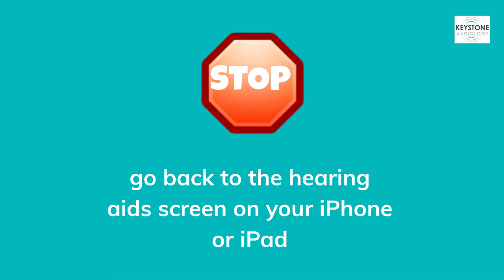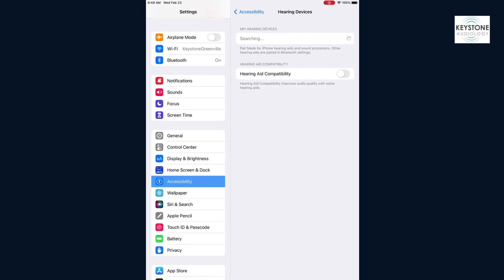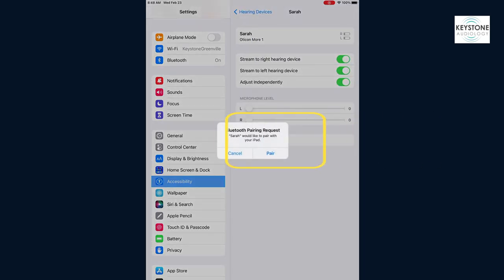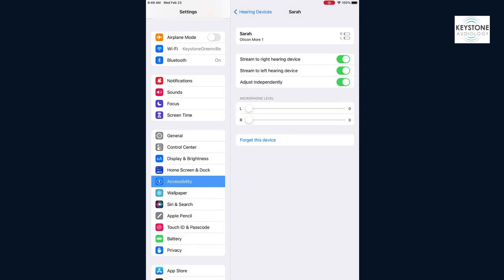Now that you've restarted your hearing aids, go back to the Hearing Devices screen on your iPhone or iPad. At the top of the screen, you will see your phone search for your hearing aids. Wait until your name pops up and you see both R and L for right and left. Clicking your name will prompt you to the Bluetooth pairing screen. You should see two pop-ups or Bluetooth pairing requests. Be sure to hit Pair for each of the pop-ups.